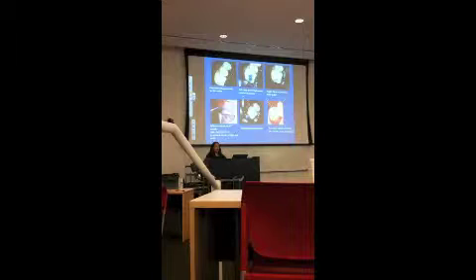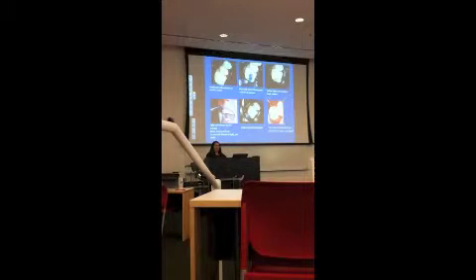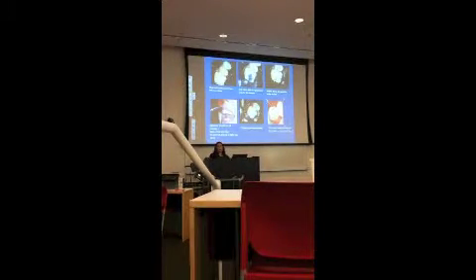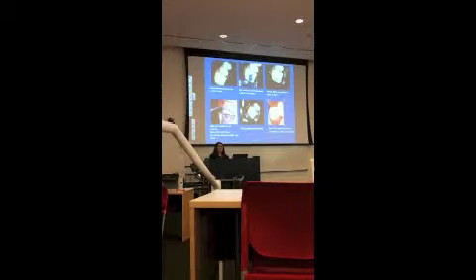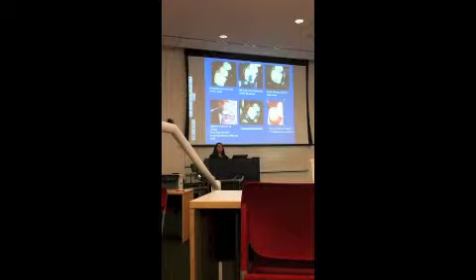So you're going to go ahead and clean the tooth with the pumice, and then dry really well, isolate the area, apply etchant for about 20 seconds. Usually I replace the cotton rolls after I rinse the tooth because as you're rinsing, you're going to get them wet anyway, and you may get some etchant on there. So I replace the cotton rolls at that point, and then dry the tooth really well.